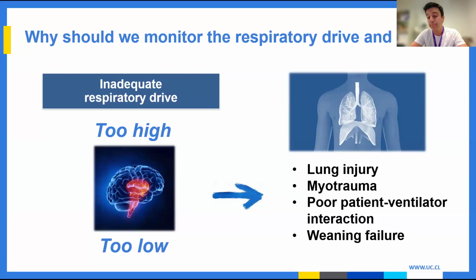It can also lead to poor patient-ventilator interaction, reflecting different types of patient-ventilator desynchrony. And of course, all together, this can cause weaning failure and affect patient outcomes.